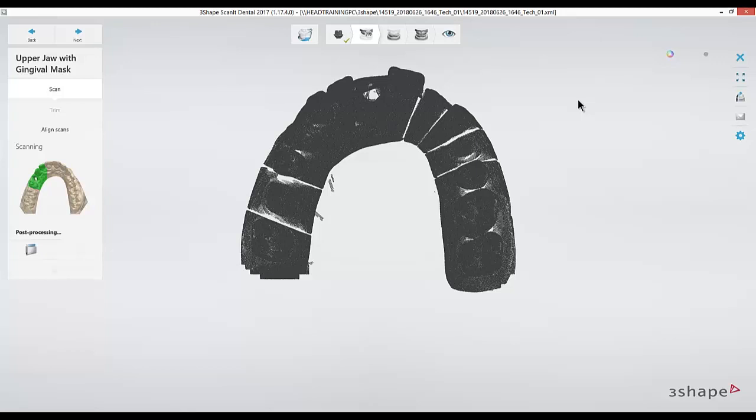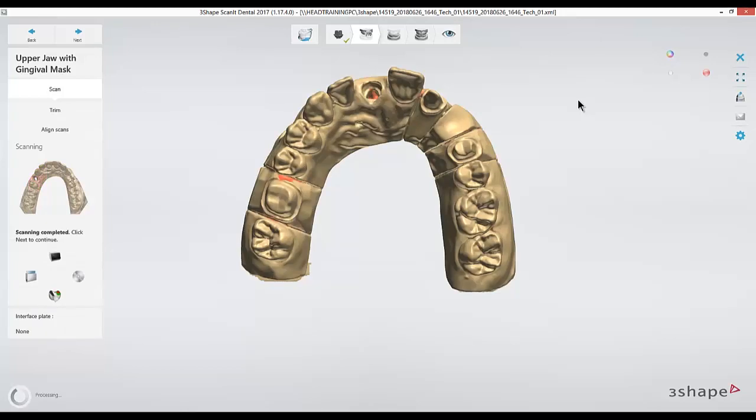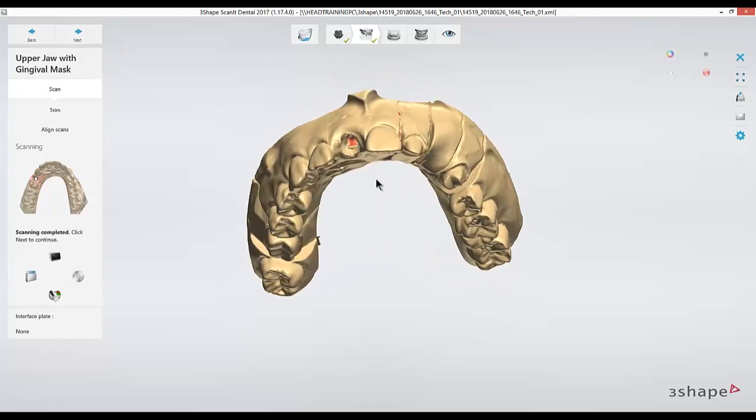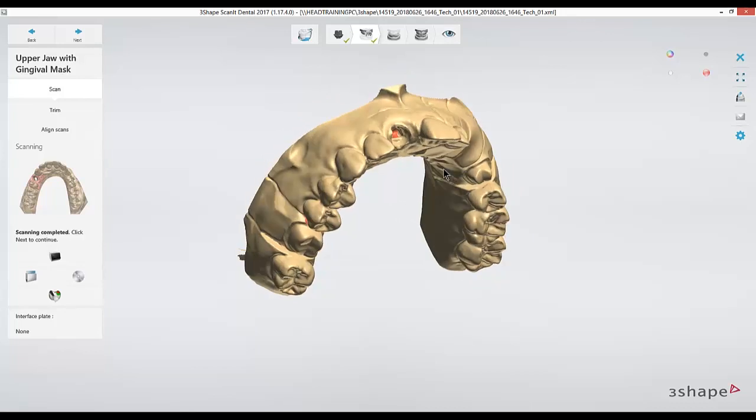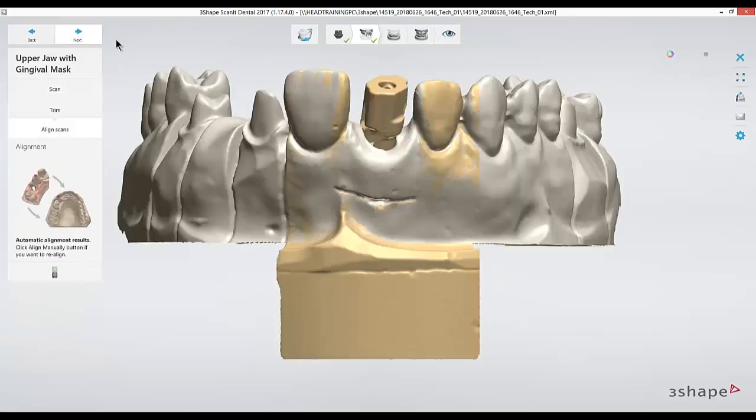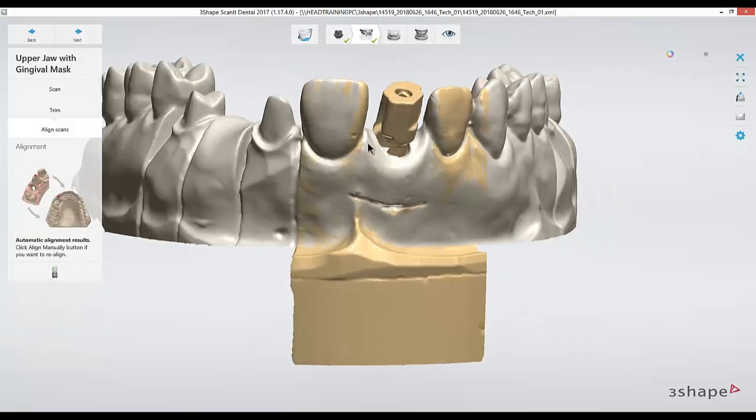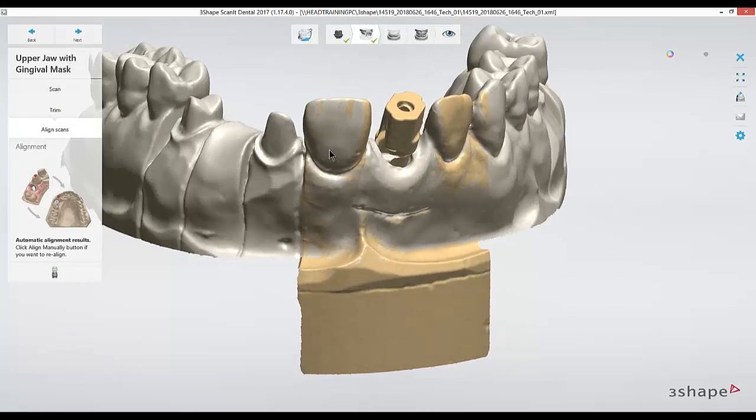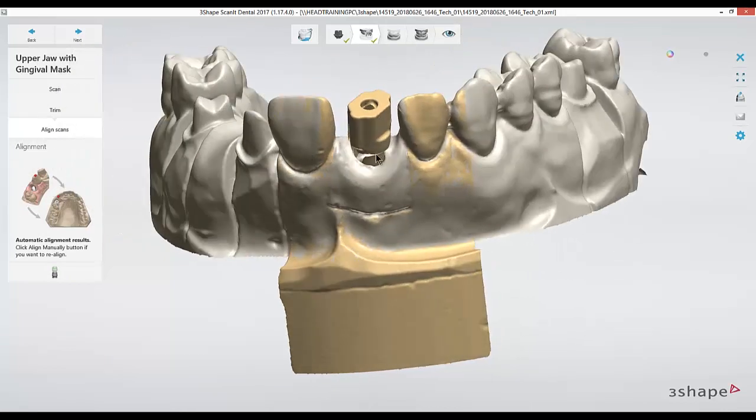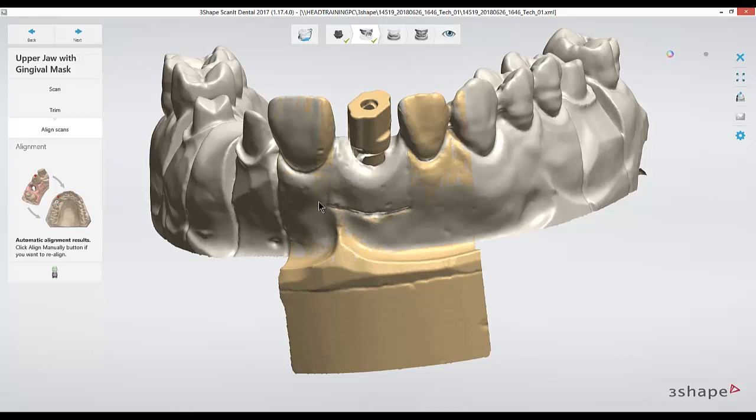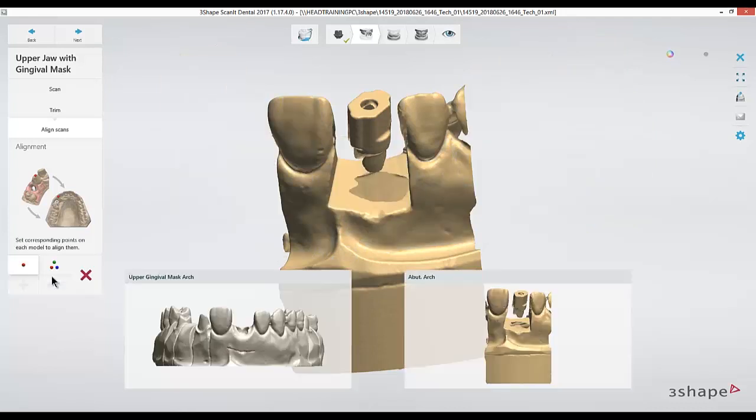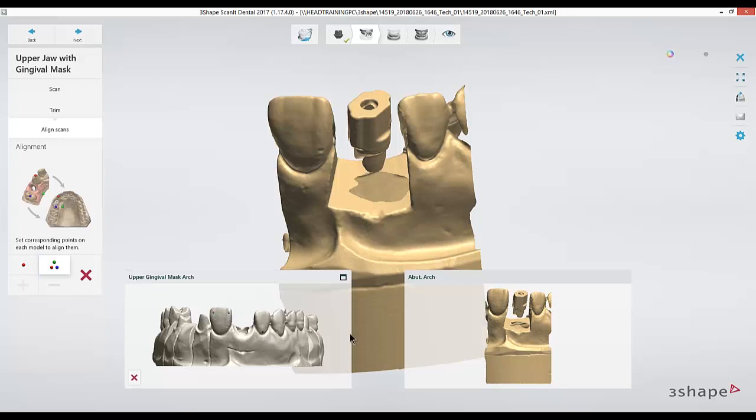Once the detail scan for the gingival mask is finished, we'll have to line up the gingival mask scan to our scan flag scan. In this case it's lined up automatically, which it should do most of the time as long as you did not have to take your model off of the putty to move these components on and off the model. If it wasn't lined up, you're able to click the align manually button and use one or three points again in a triangular manner to get a good realignment.